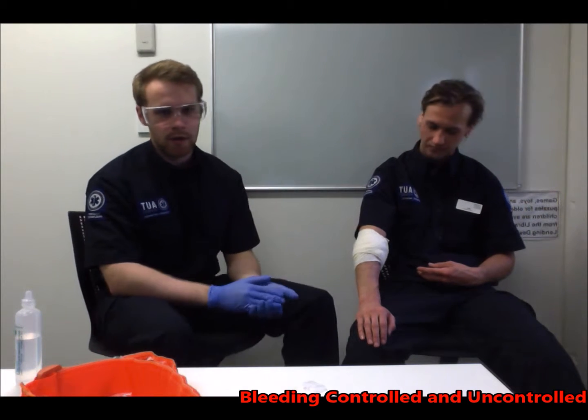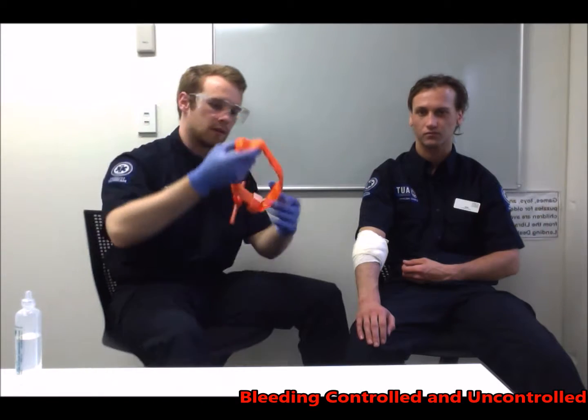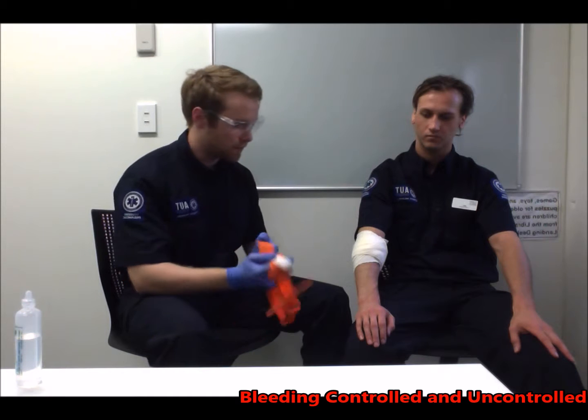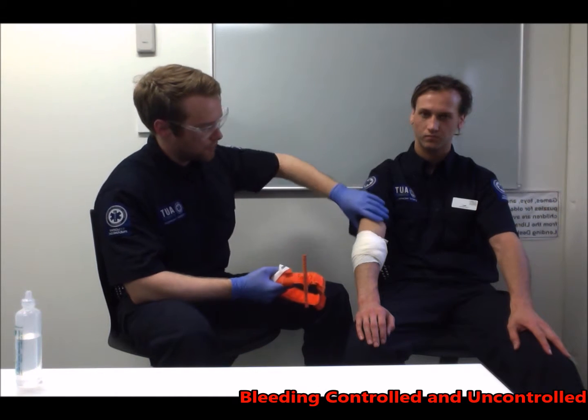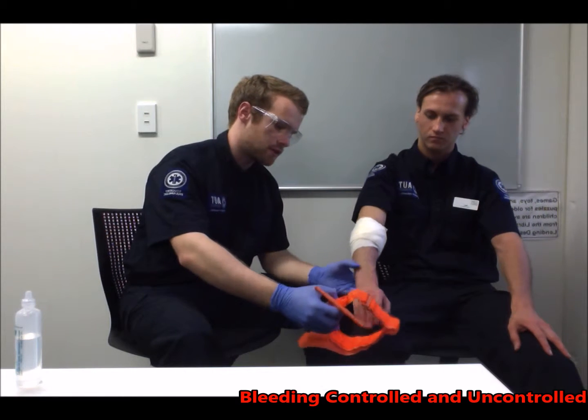So if it is quite catastrophic, the hemorrhage, you can also apply a tourniquet. These get applied 10 centimeters proximal to the wound. So if the wound here is on Sam's forearm, we're just going to put this tourniquet up on his bicep up here. So if I could just get your arm through here, Sam.